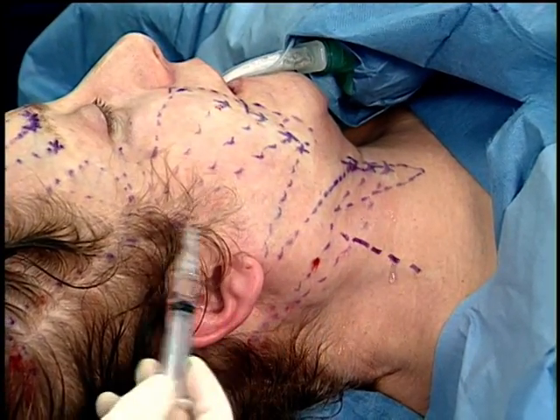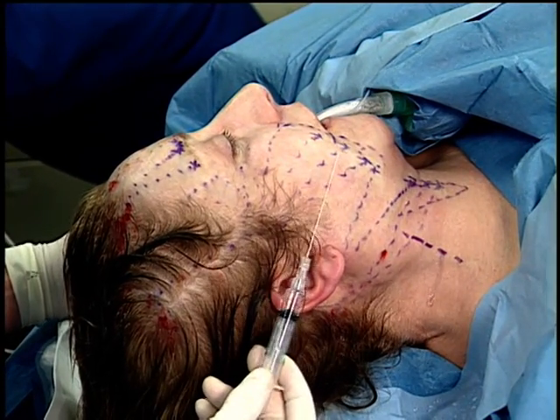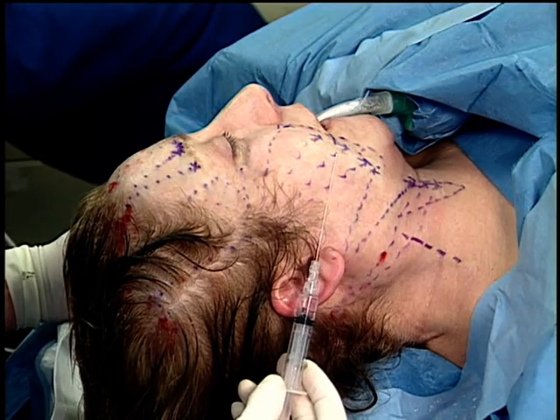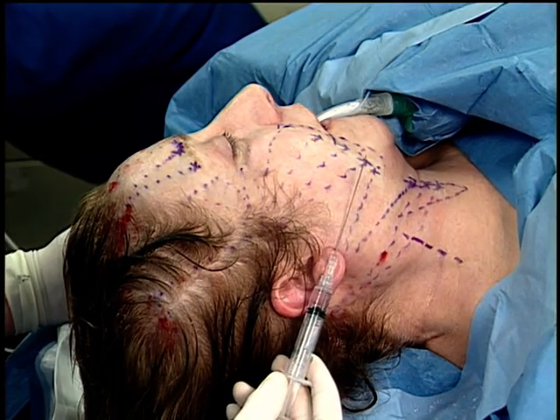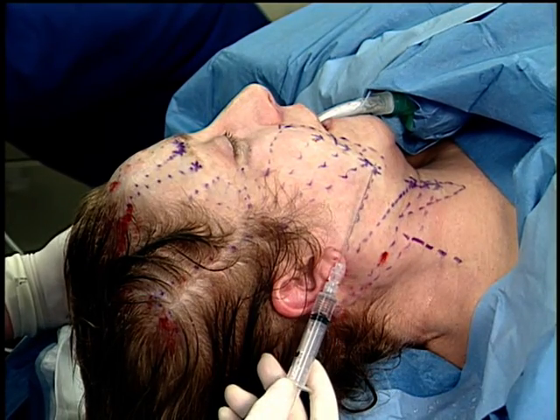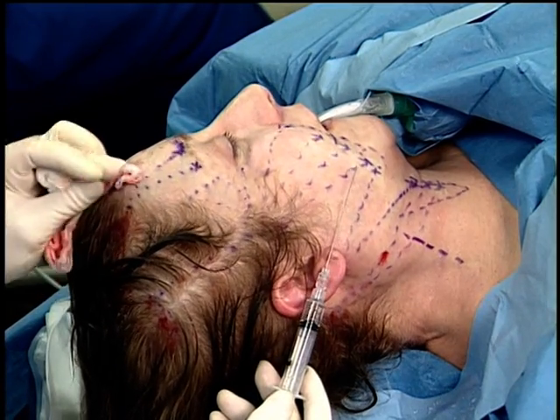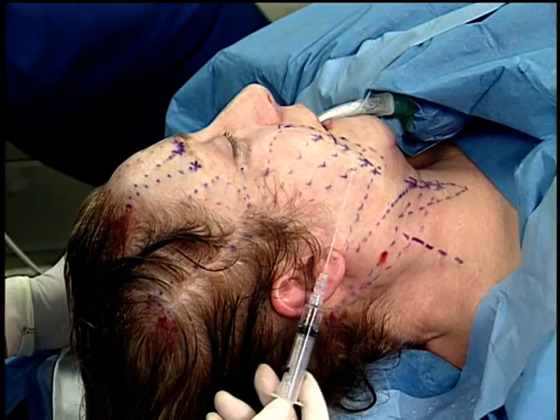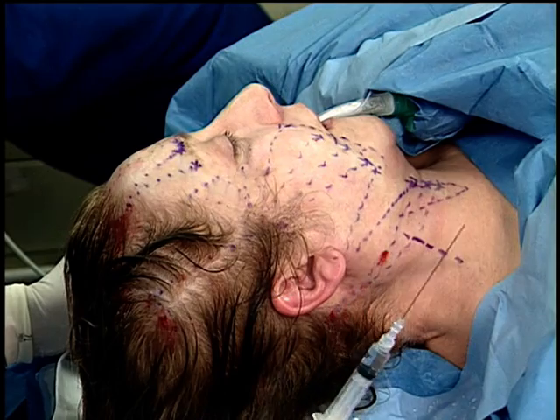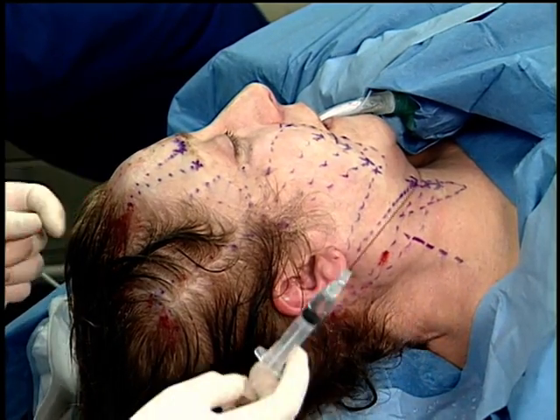We've now done our tumescent anesthesia on the entire side. I have used approximately 15 of these, 12 of these. So I have used about 60 cc's of 0.5%, which leaves me another 60 for the other side and 30 cc's to spare, given the 7 milligram per kilogram formula and 0.5% xylocaine. This completes our tumescent anesthesia.